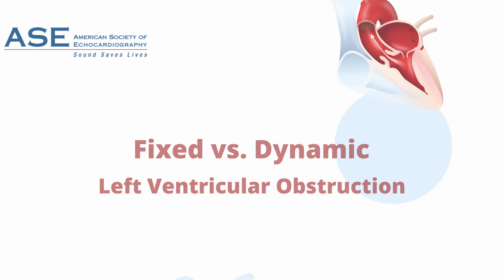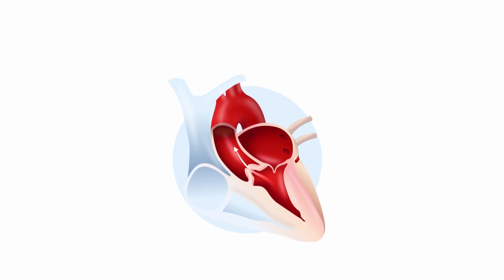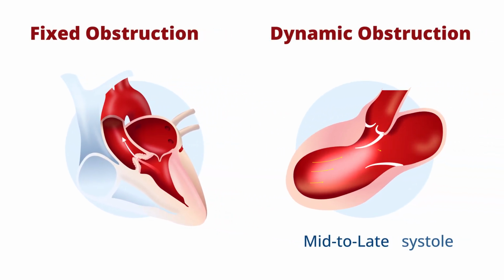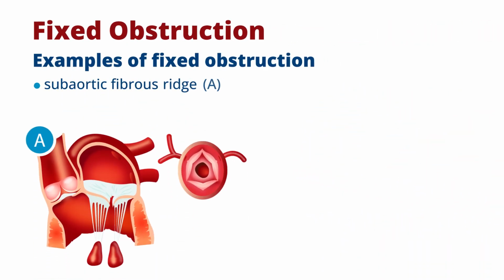When Doppler interrogation shows an increased left ventricular outflow gradient, it is important to take a moment to determine whether the obstruction is fixed versus dynamic, as this may influence patient management.